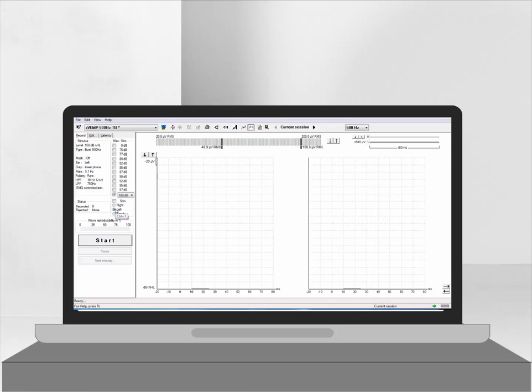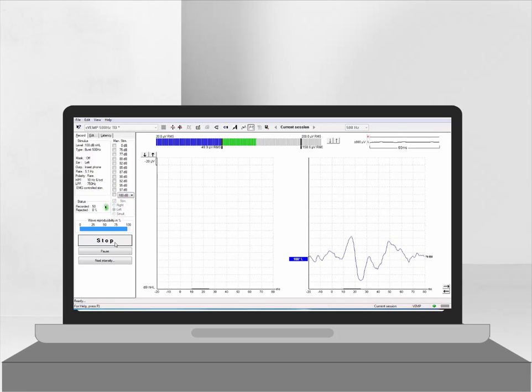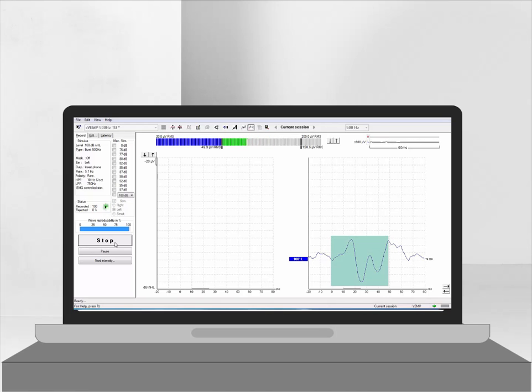In this example we begin to stimulate the left ear at 100 dB NHL. Notice that within very few sweeps we are able to obtain a large C-Vemp response which is distinguishable from the background noise.